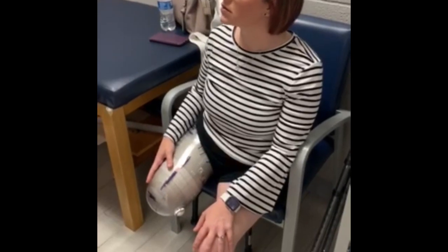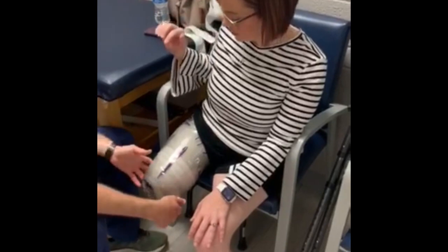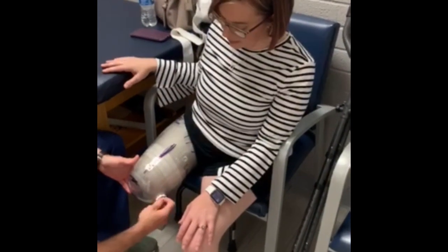But you'd want to make sure you're back in it again. Back in all the way. Now, if you're taking it off for good or any other reason, you're going to remove that, just completely remove it. Okay.